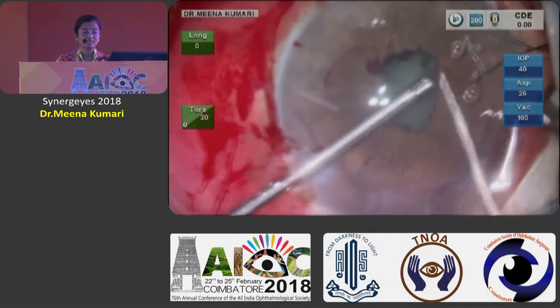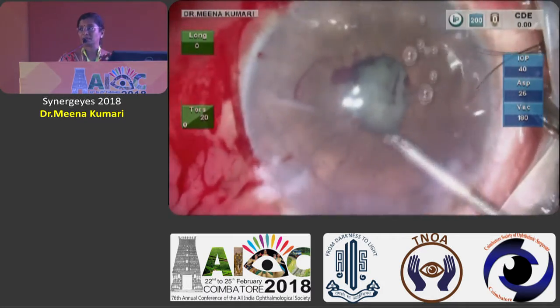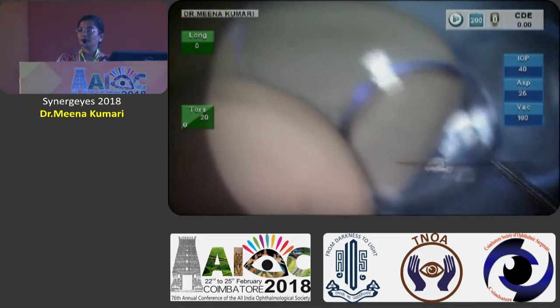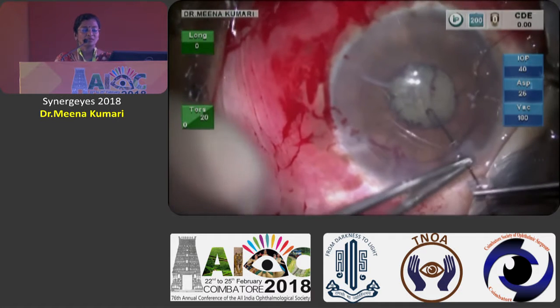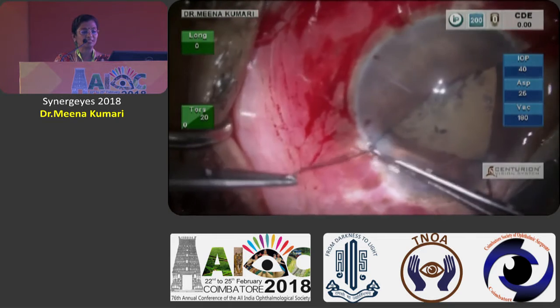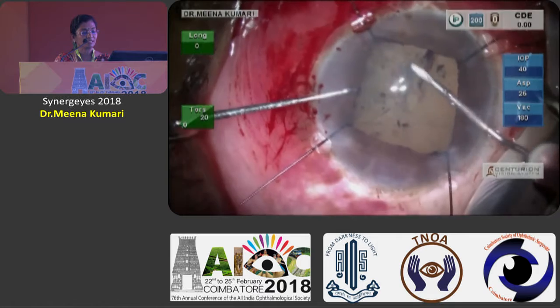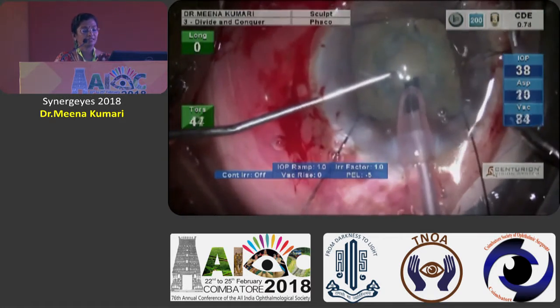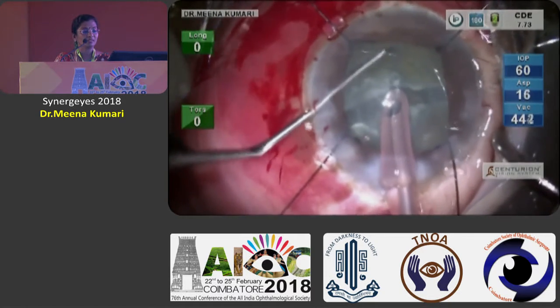The patient's expectation nowadays is for cataract surgery to be performed as a refractive procedure. Whatever status I may walk into your office, I expect a clear cornea, a round pupil and a quiet anterior chamber the very next day. So in this case too, the desire to give the best for the patient was there. I understood it's a very soft and sticky cataract, and there was a big thrust from the vitreous pushing the lens iris diaphragm and shallowing the chamber also. So I opted for 60 intraoperative pressure.